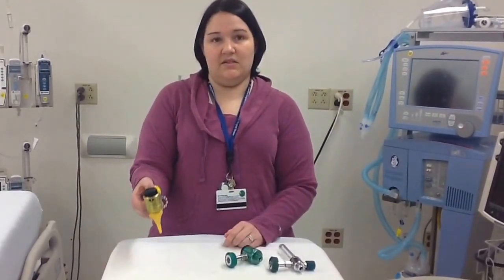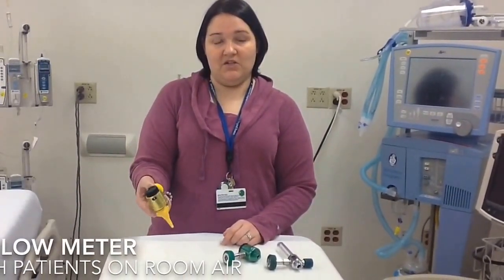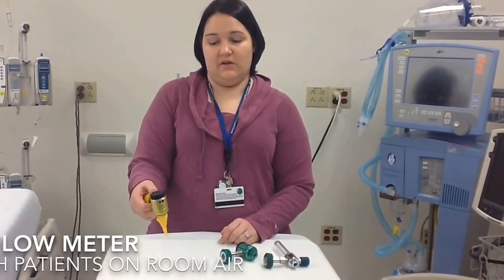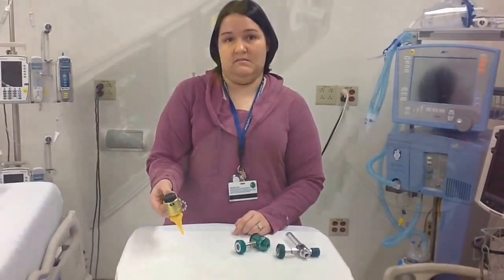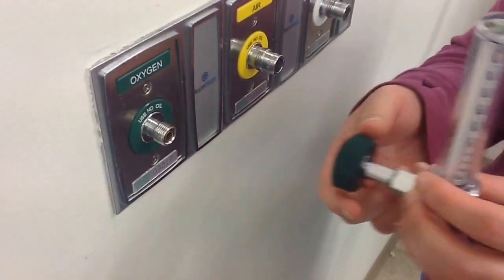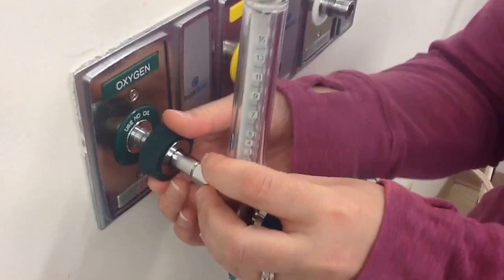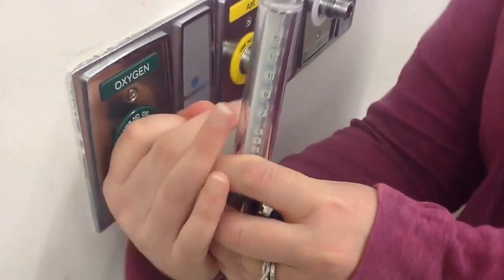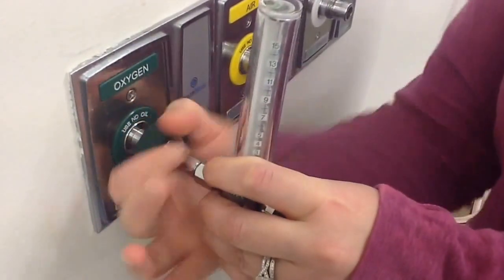And the last one we have is an air flow meter. It's reserved for trach patients only to deliver humidity for patients who have no oxygen requirement. It's either on 0 or 8. So when placing these on the wall, you want to screw it in, and you might hear a little bit of air. It's because it's under a lot of pressure.